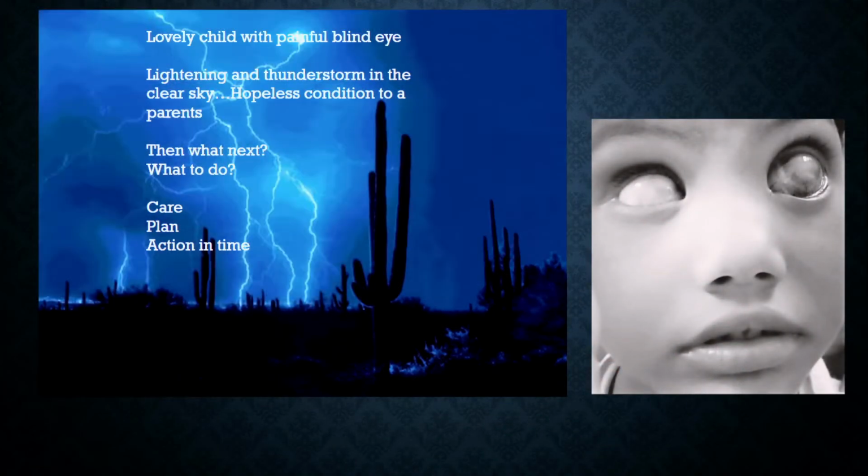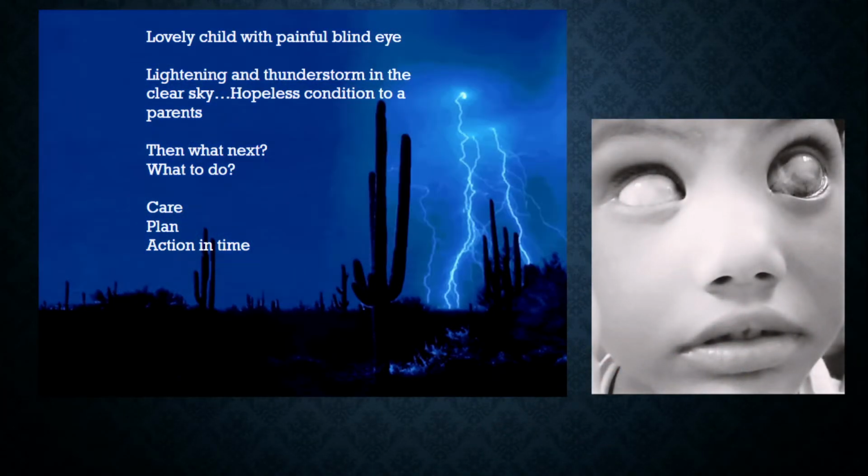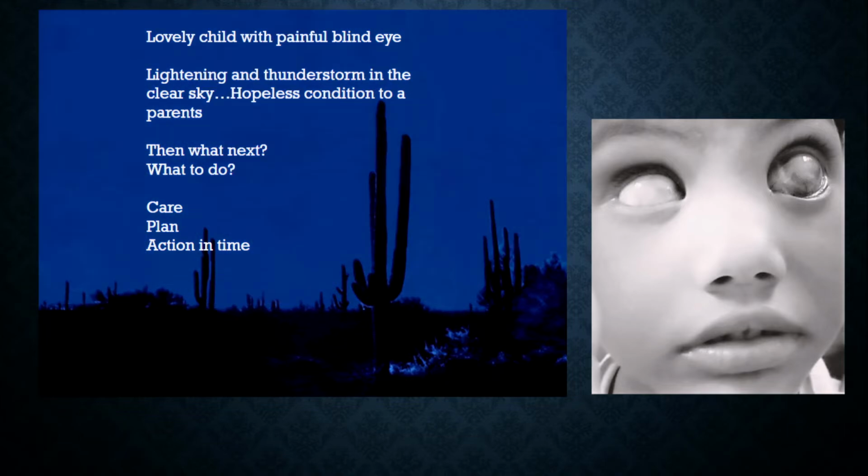Sirisha, what about you? I think he asked you as well. Would you do it for every child with a corneal opacity? I don't have UBM in the OR, we have it in the clinic, so we try and innovate and do that in the clinic even before you take it up. But intraoperative OCT, the anterior segment OCT, the handheld one that is mobile, is something we have. The only issue is that you need somebody who's well trained to do that.